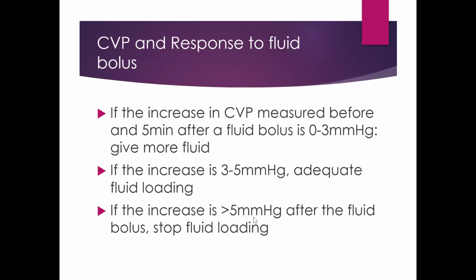If the increase is more than 5 millimeters of mercury after fluid bolus, it is an indication that you should stop fluid loading. So these are very, very important, especially in assessing fluid status and response to fluid bolus in our patients.